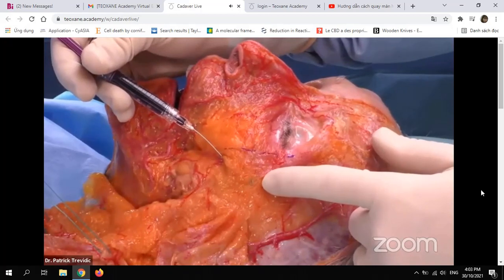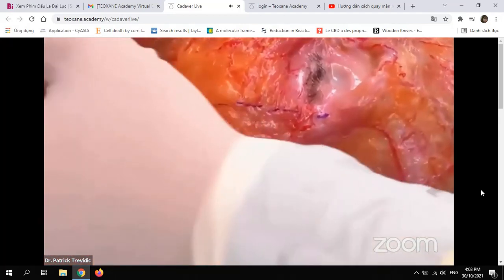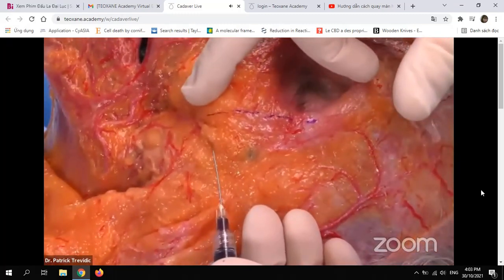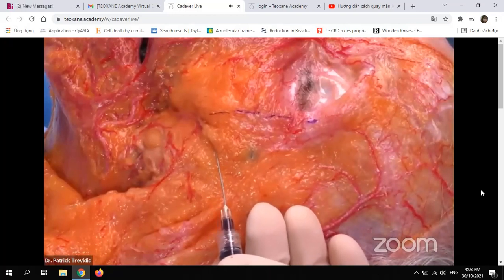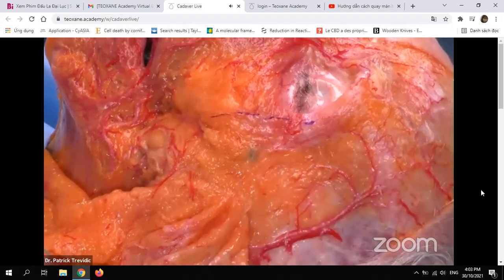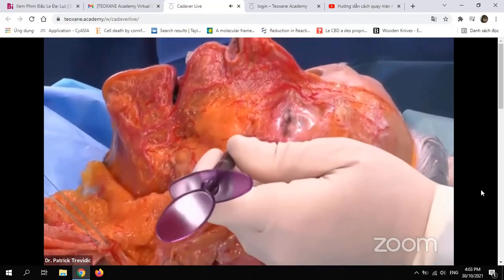If we focus on it, she did small boluses here that you can see in blue. And the last point, if we dezoom a little bit, but not too much, she was in the deep medial cheek fat compartment that is just here. So 2 layers of fat, 2 aging processes, 2 layers of injection, and 2 products. Then she moved to the tear trough. The tear trough, if we dezoom, go a little bit up, she had just an entrance point here.